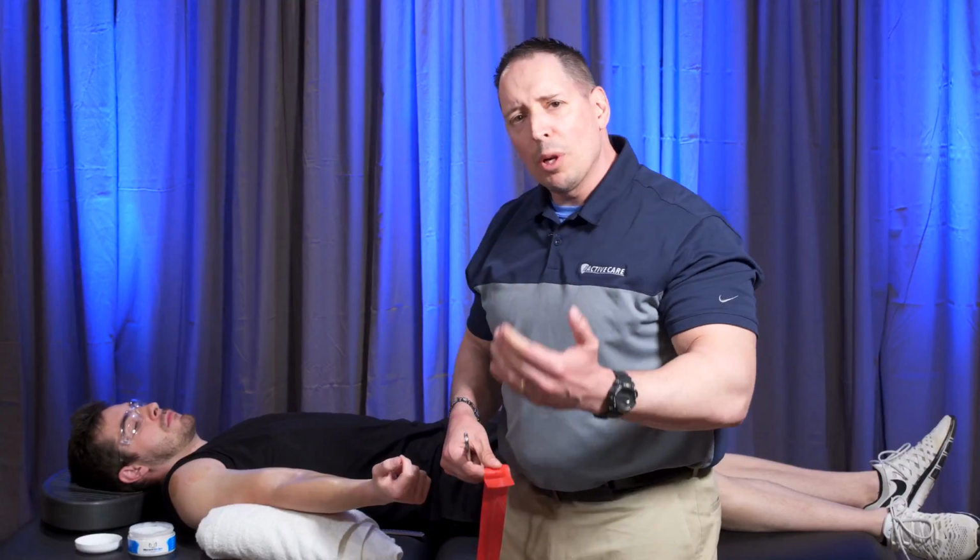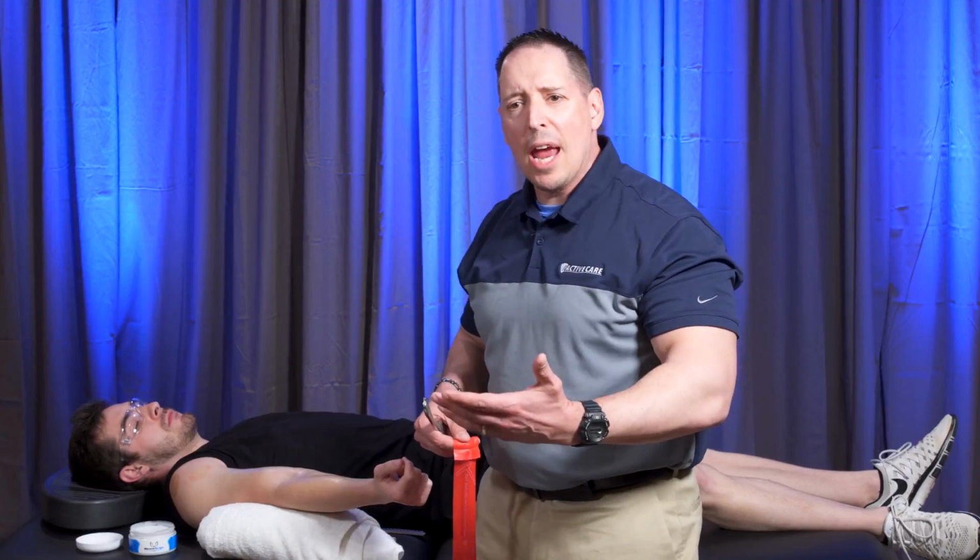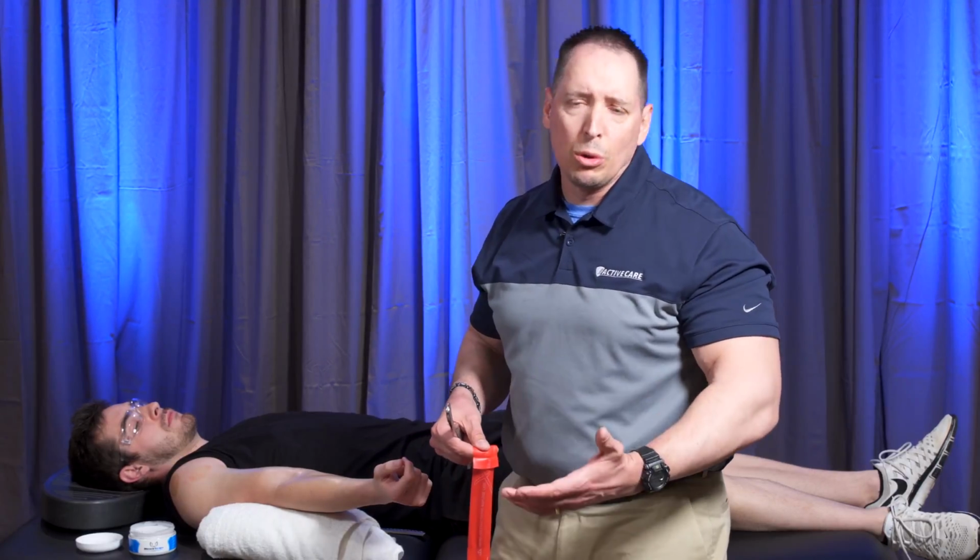So we want to put just a little bit of pressure. We don't want to set off any neurological responses, co-contractions of the extremity, and I've seen it happen multiple times in people. So what I do is we think about this. If you're waiting for a bus to come and you're standing and someone pushes you, the first thing you do is hold your ground or push back. The same thing with the tissue.